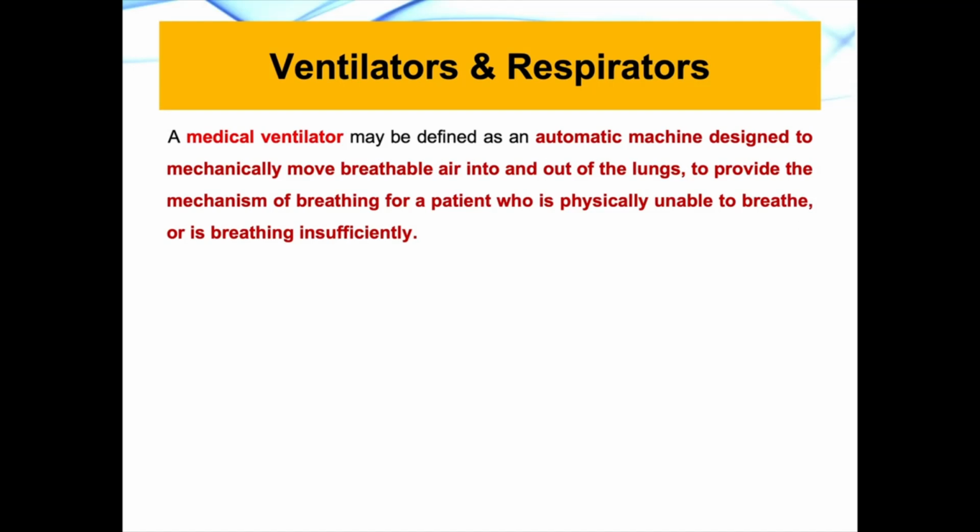It is an automatic machine designed to mechanically move breathable air into and out of the lungs. Mechanically is a very important thing to consider, in order to provide the mechanism of breathing for a patient who is physically unable to breathe. This is a big distinction from inhalators, where the patient is expected to be breathing on his or her own, or is breathing insufficiently. That's a very important distinction between ventilators and inhalators.